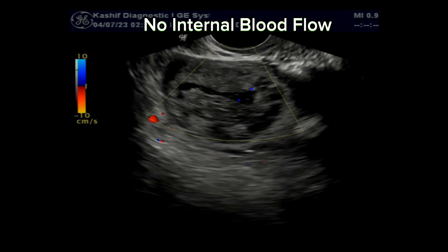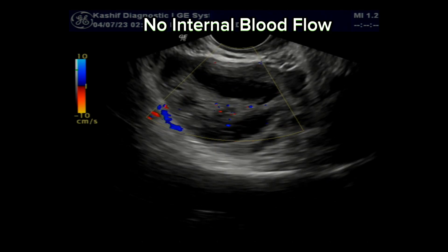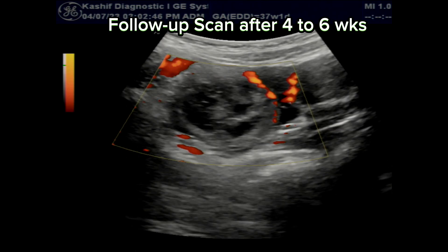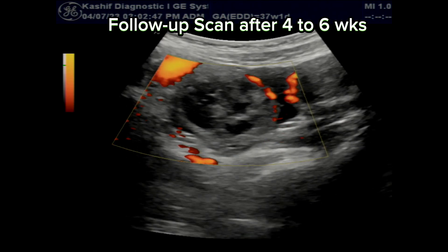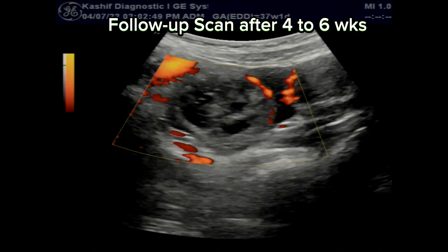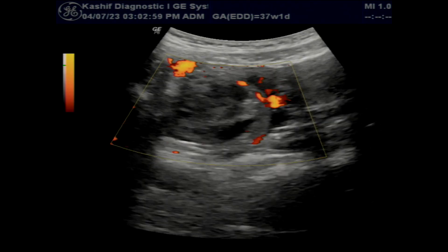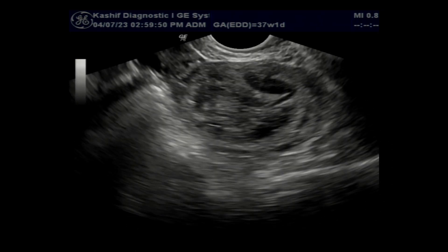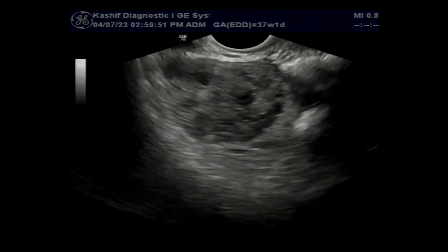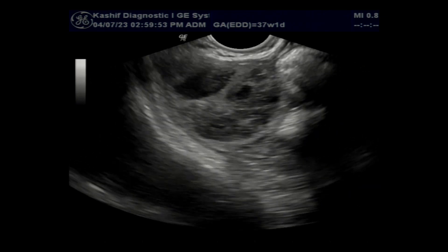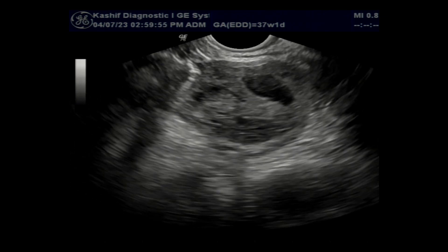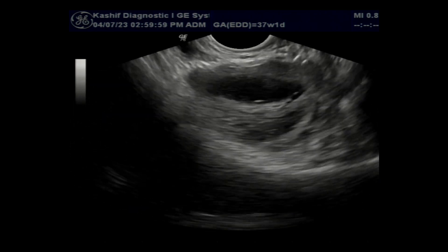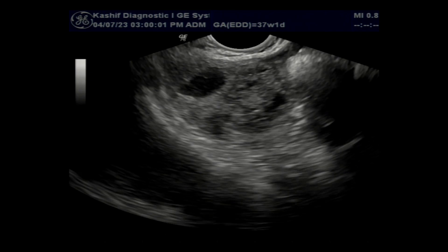There is no internal blood flow. A follow-up scan after 4 weeks will show a dramatic change within the hemorrhagic cyst in terms of size, internal echogenicity, and components. Also, these are not solid components — these are only hyperechoic areas and clots, and thick strands that represent blood clots.